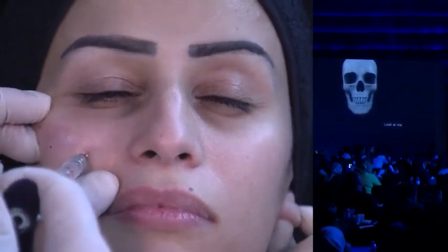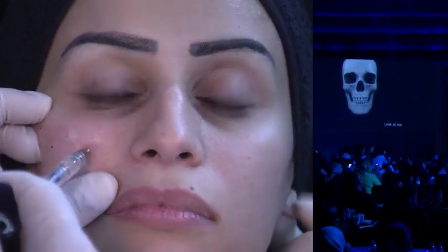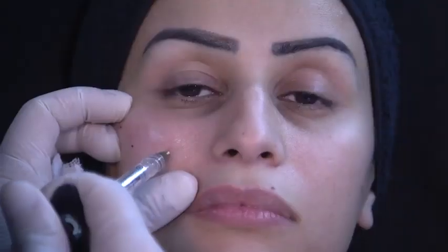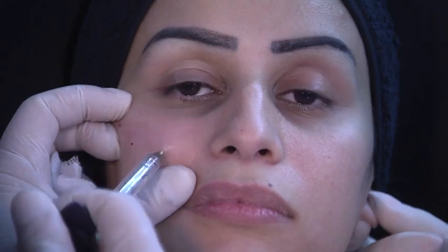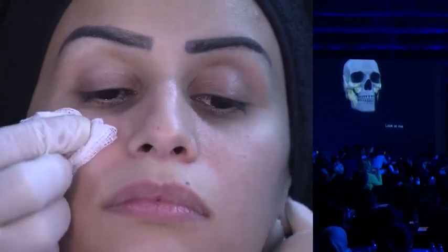Right. So I'm in the middle, I'm lateral to facial artery, and I'm lateral and lower than the infraorbital notch. Okay. So I will do my final bolus here of 0.35. It's exactly below the fat pads, and I'm touching the bone all the time. That's it.